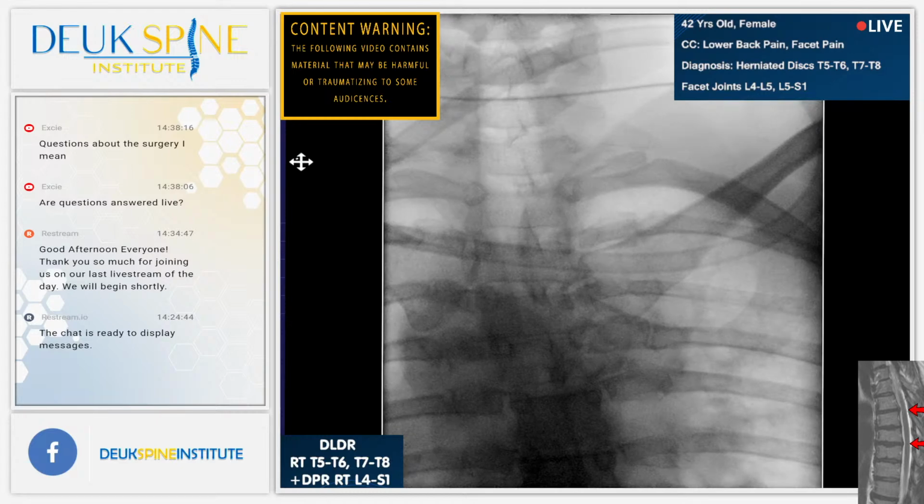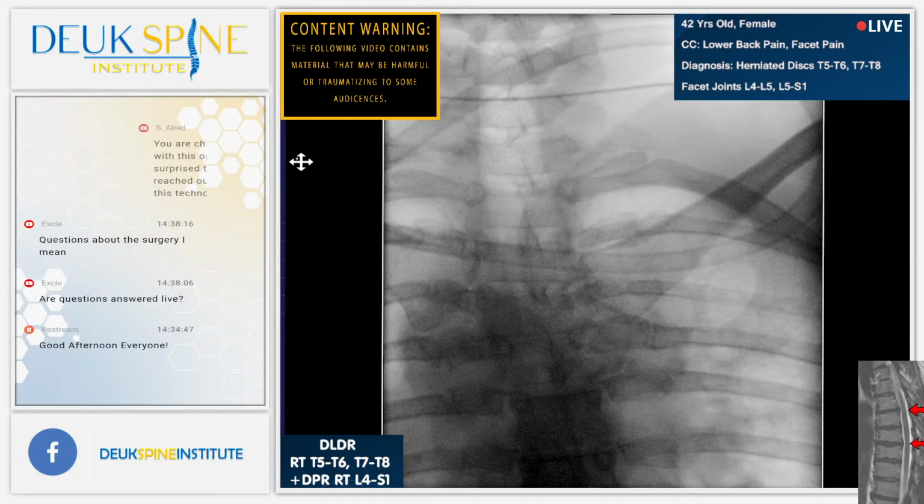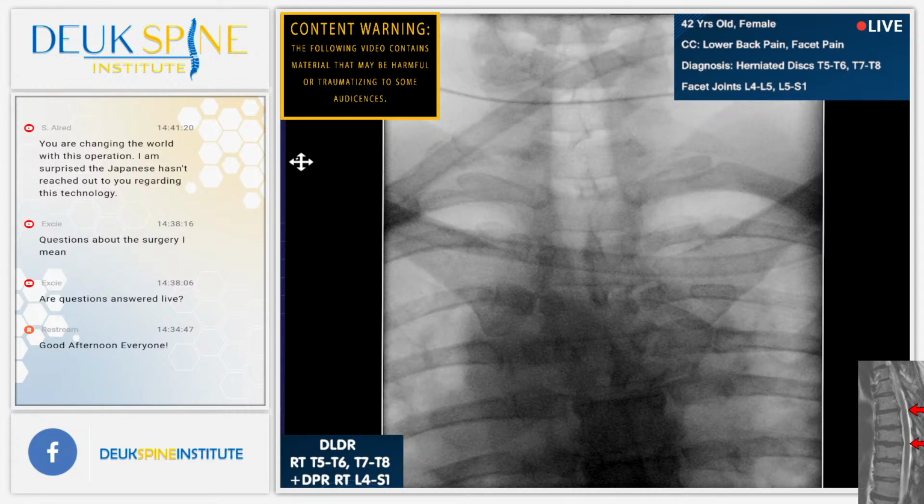I'm not seeing a clear T1 rib. Can you bring the fluoro a little bit to you? And shot. I don't mind if I see the rib on either side. What is that right there? Is that the ET tube? No, what is that structure there? Not that. The big tube-like thing. Oh, no, it's not an ET tube. Okay, get that out of the way, please. That's confusing everything. Let's take a look again.